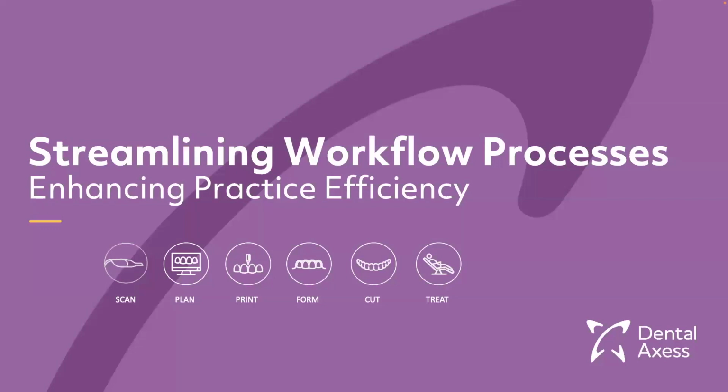Okay, so we've spoken about treatment planning, but also an efficient workflow process is crucial for a thriving practice and for labs. It's essential for maximizing productivity, optimizing resource allocation and utilization, and delivering high quality dental care in a timely manner. Maintaining seamless communication between practice and lab is essential. And so let's explore how Xflow revolutionizes practice to lab communication, streamlines workflows, and enhances collaboration.